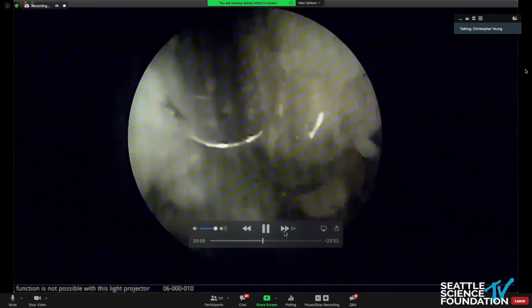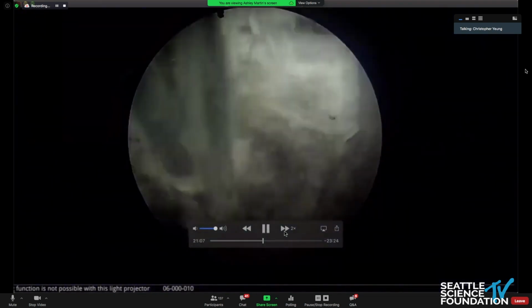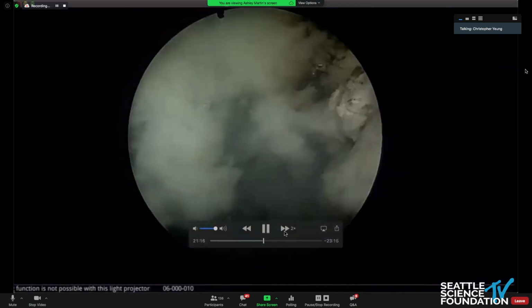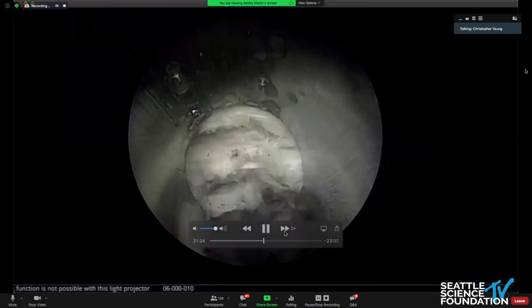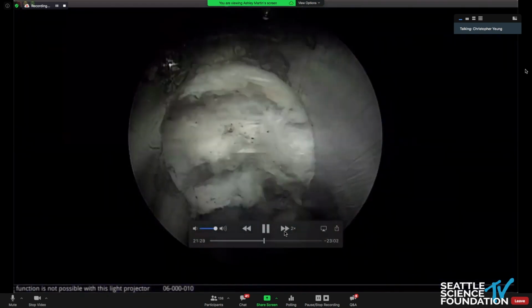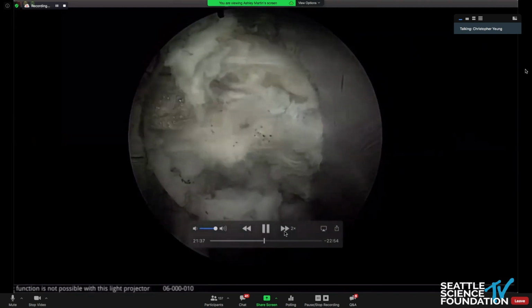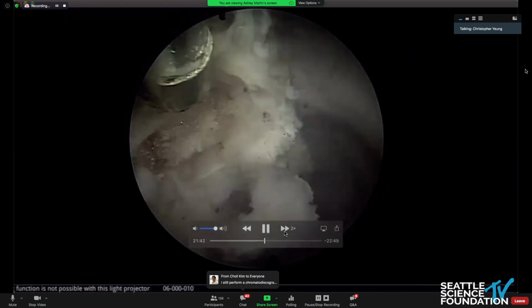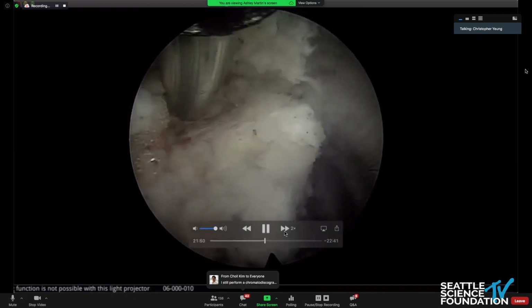So now, after we've done the pituitaries, we're going back into the disc. We'll look in the epidural space and we'll look in the axilla of the nerve roots. Certainly if it's a foraminal herniation, you're going to want to try to see the edge of the nerve root and/or the posterolateral corner of the cephalad vertebral body. If it's a paracentral herniation, you'll want to see the traversing nerve root and epidural space.